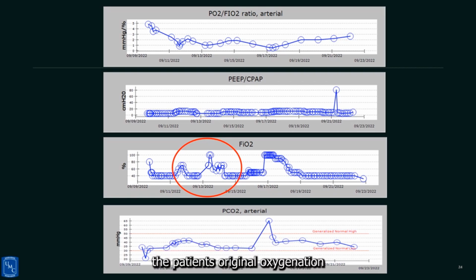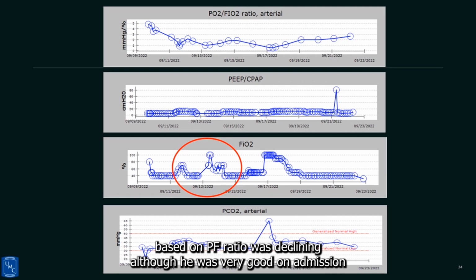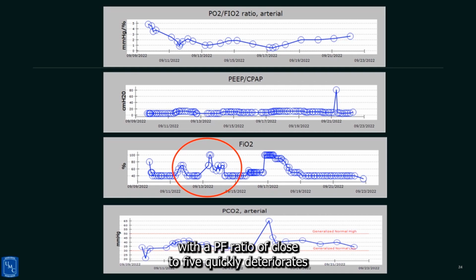The patient's original oxygenation based on PF ratio was declining, although it was very good on admission, with a PF ratio close to 5. It quickly deteriorates to nearly 1 on 9/11 of 2022. You can notice that the PEEP is not changed; PEEP continues at a low value. The patient was also on SIMV, with an initial PCO2 decline as low as 20. SIMV in this patient who is seizing is probably triggering unwanted breaths delivered to the patient.